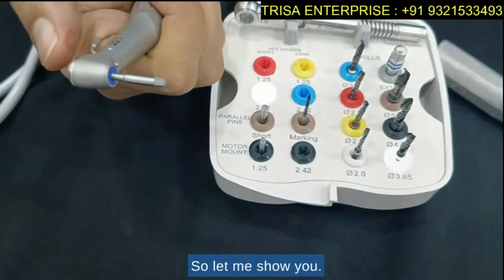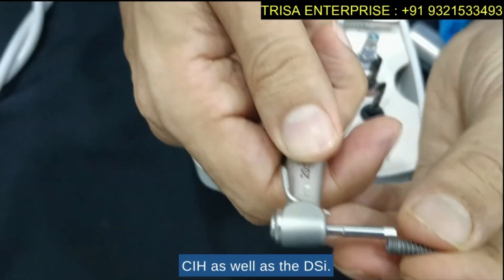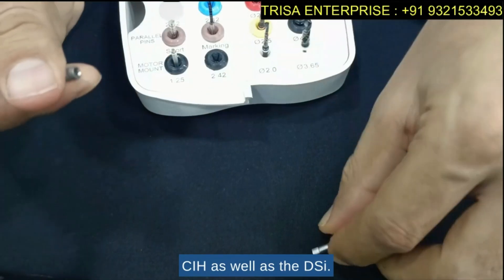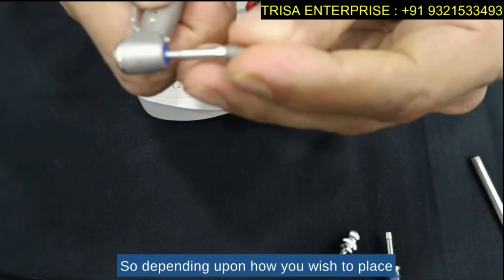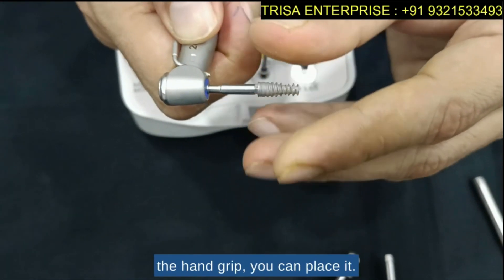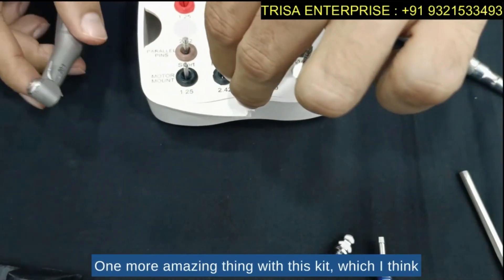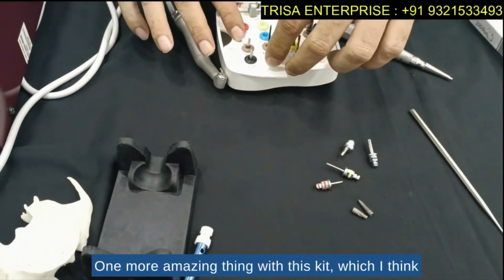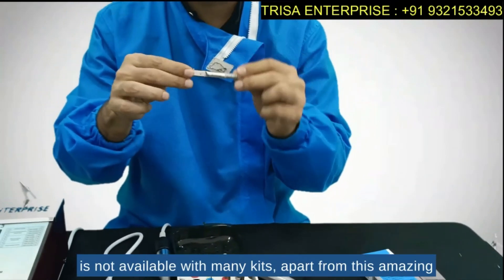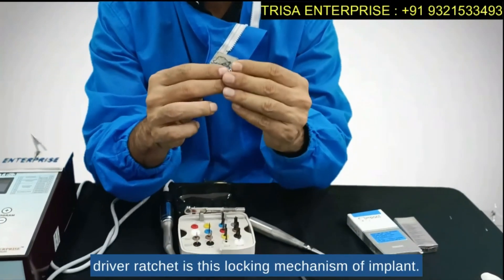Let me show you — this motor-compatible design is compatible with both the CIH and the DSI. Depending on how you wish to place the implant, either with the motor or with the hand grip, you can do so. One more amazing feature in this kit — which I think is not available with many other kits — is this locking mechanism of the driver ratchet.